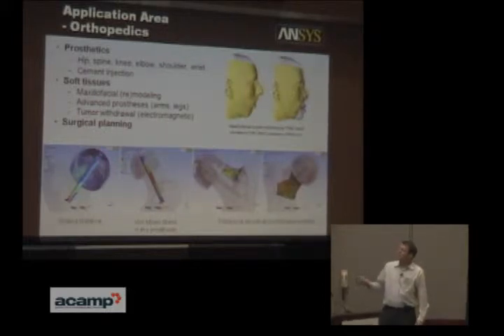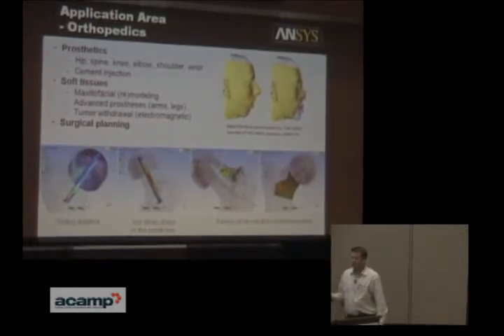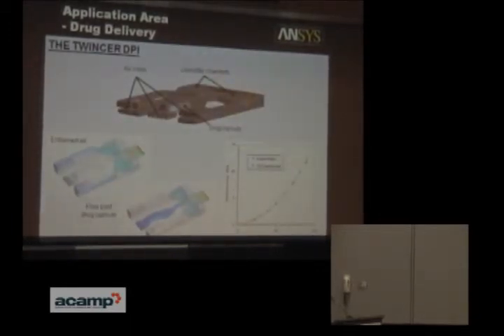We want to look at the stresses. For performance of the implant itself, what are the stresses on the prosthesis, the smaller stem going into the head of the femur? And then finally, what stresses or strains are we going to see in the bone? And just make sure that we're not affecting the overall physiologic milieu too dramatically. This is a slide that we already saw.